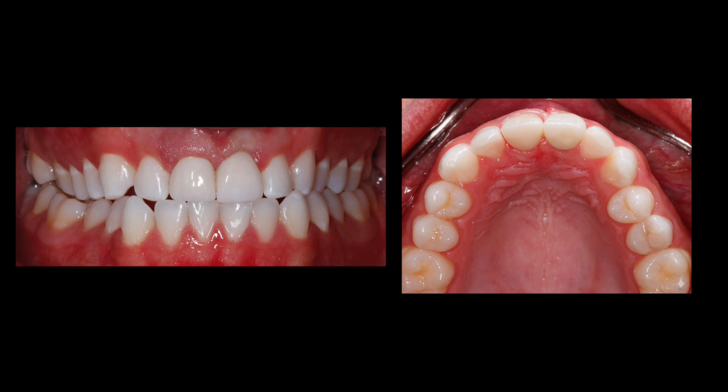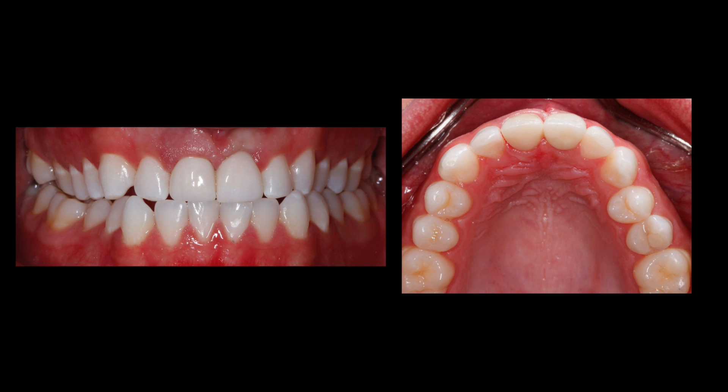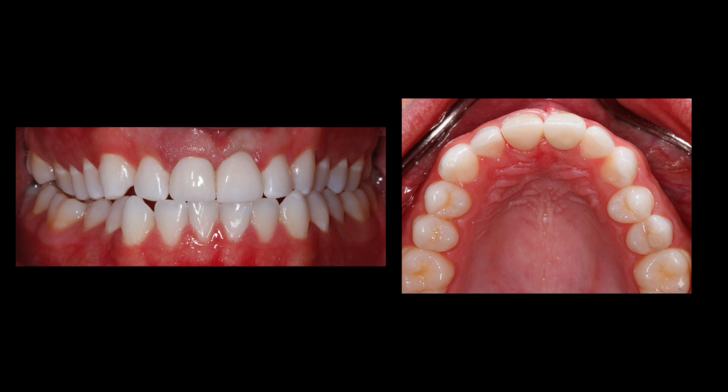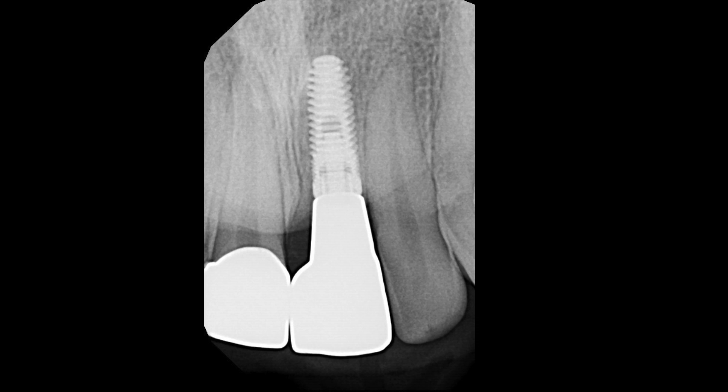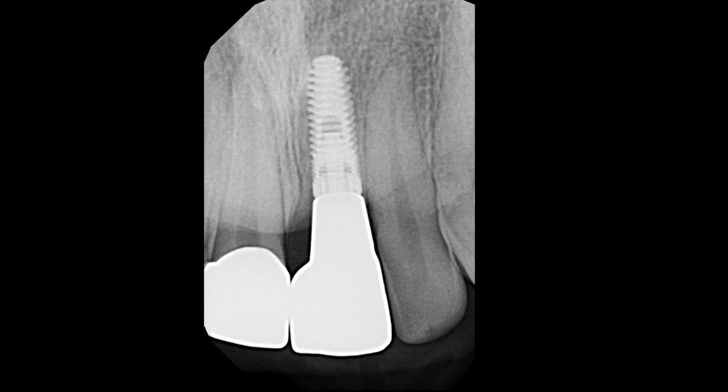The final restorations are in place and integrated very well across the arch. A radiograph shows a nicely osseointegrated implant restoration with a screw-retained crown for the final outcome of this case.